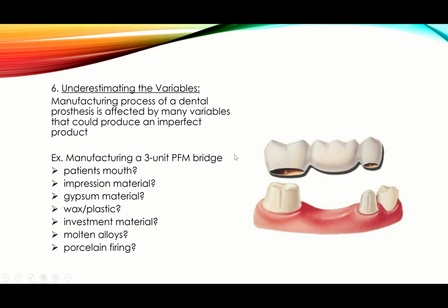Let me give you an example. Take this 3-unit PFM bridge as an example. Is the patient's mouth variable or is it a set? Could something change after preparation? Absolutely. The patient's mouth is variable. Things could change: the gum, if the temporary is pushing the gum, whatever. Many things can change from the initial impression that you took a week ago.